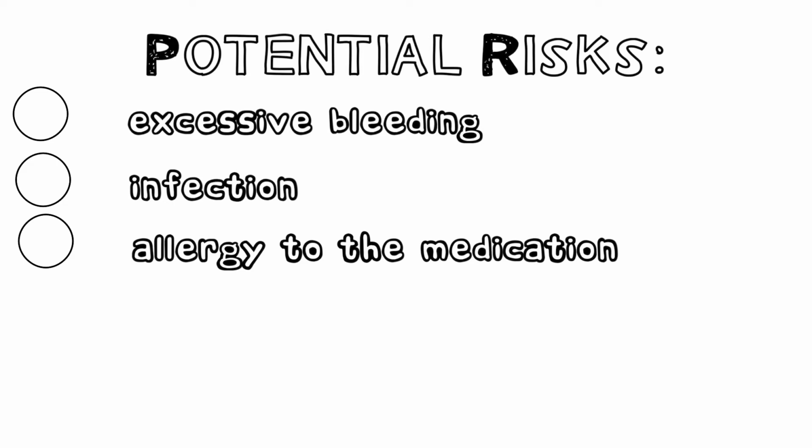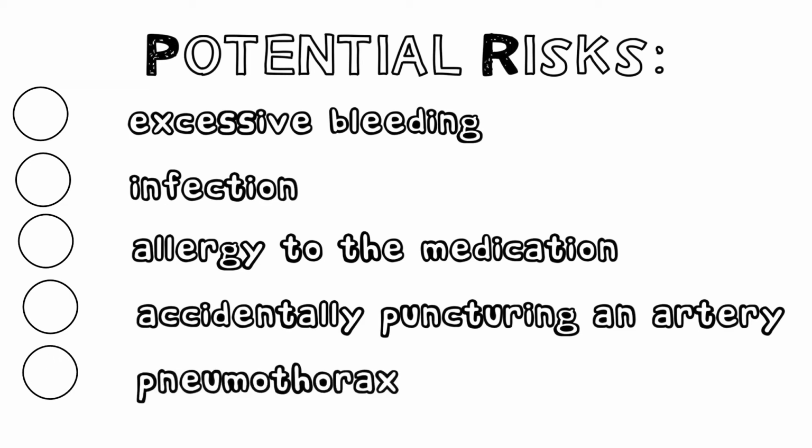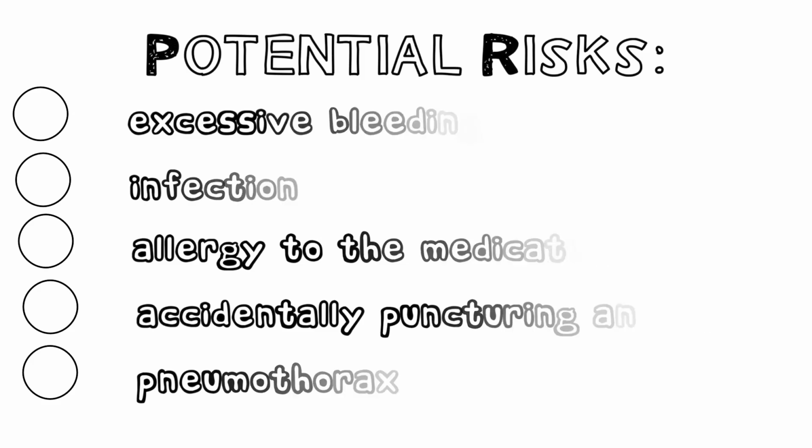During central line placement, there's also potential risk of accidentally puncturing an artery instead of a vein. And in that situation, we have to hold pressure on the artery for a long period of time. There's also a potential risk called a pneumothorax, where sometimes the wire that we place inadvertently punctures the lung. Obviously, we're going to minimize all the risks and complications associated with this procedure, and we'll be right there with you in case any of these are incurred.